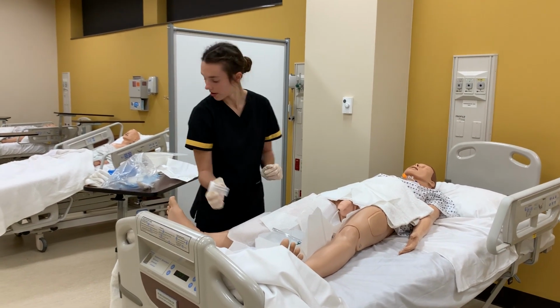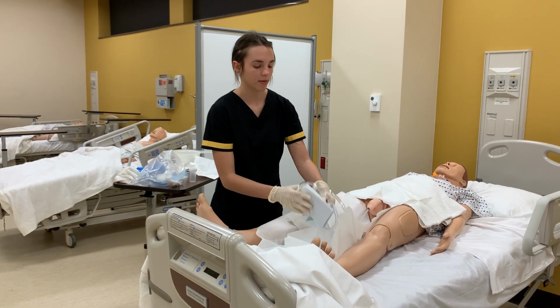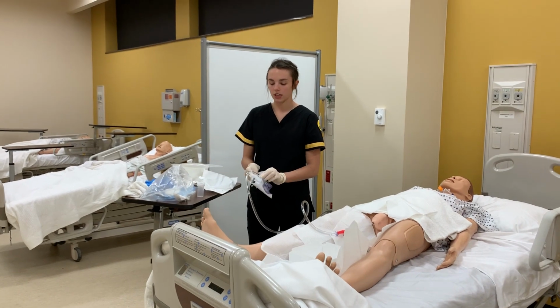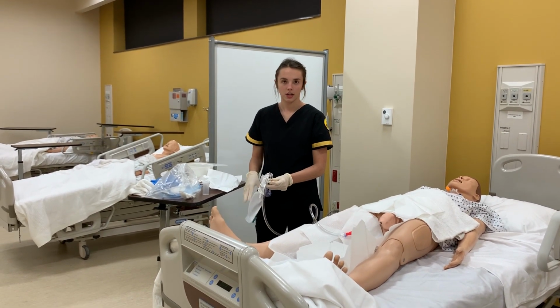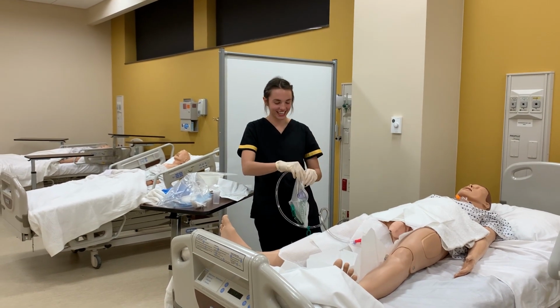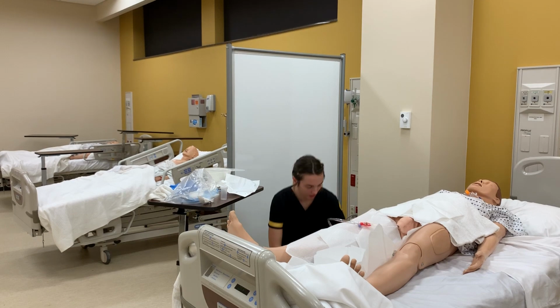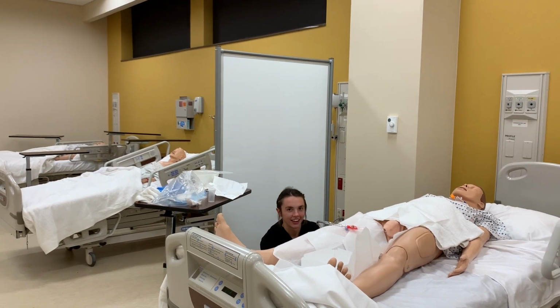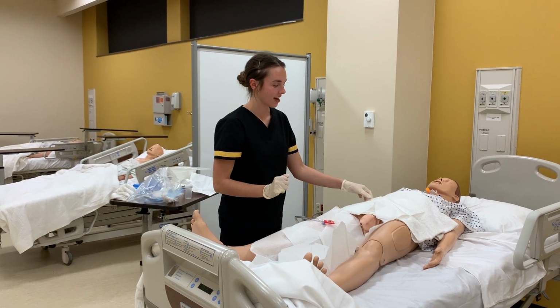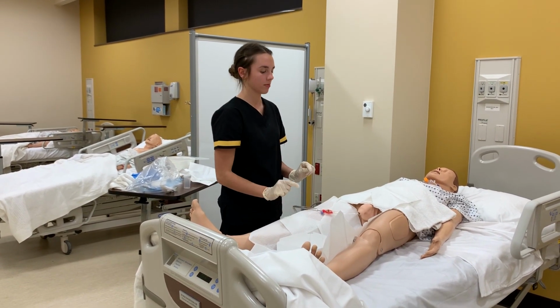So now we have it in, and I can take the bag and we're going to hang it on the side of the bed. And it's very important to always have it below the level of the bladder. And here we go. So we would also remove all these drapes.